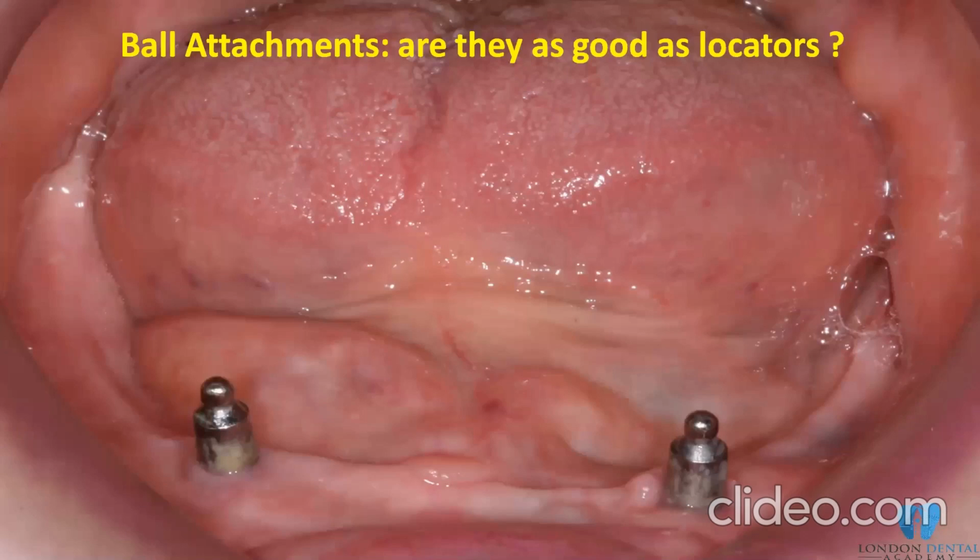Another lady, I think, was referred to me from Royal London, was treated 35 years ago, and she had these lovely ball attachments. I think it's very good treatment, nicely placed implants, as you can see, straight, parallel, but the denture was, as we'd imagine, loose. And the reason is that the ball attachments are worn down.